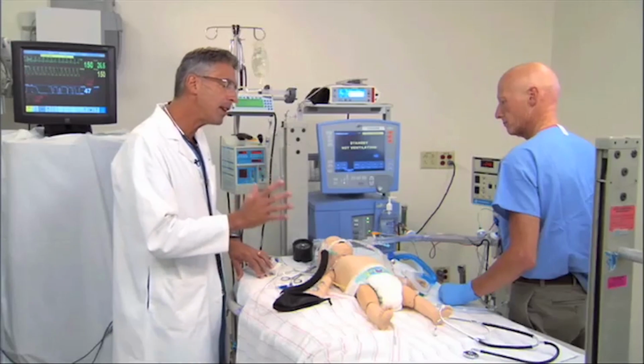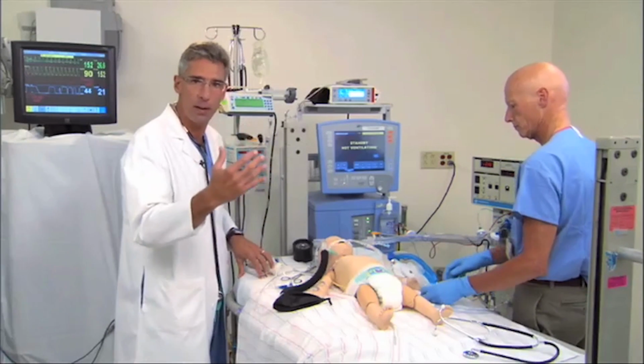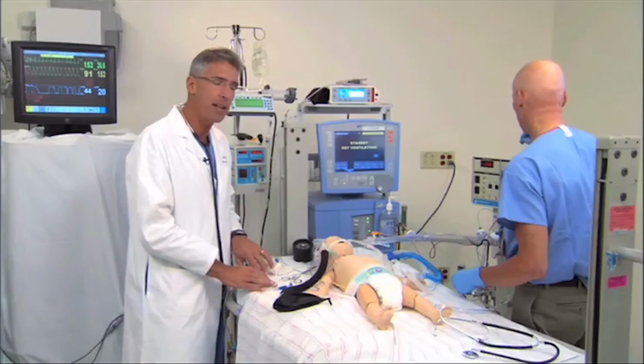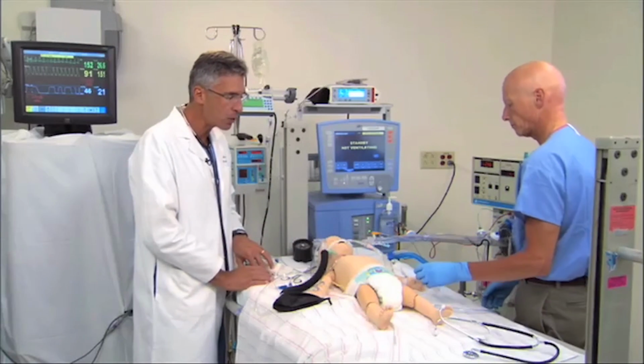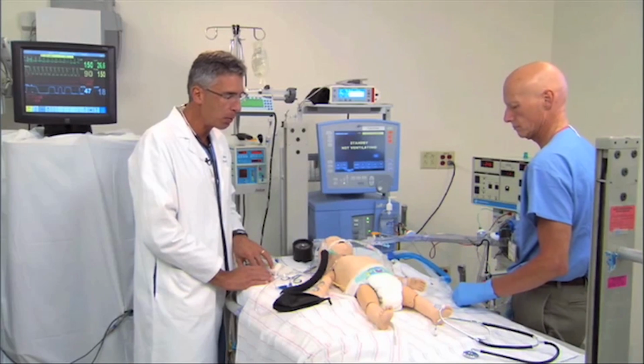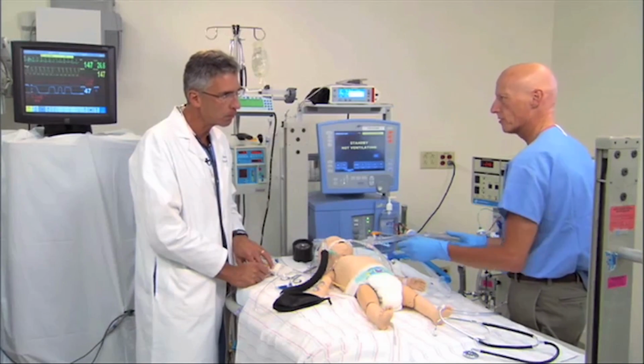Now, I think it's best to underdo it in terms of chest wall displacement rather than overdo it. Again, our goal is to prevent ventilator-induced lung injury. So I think now with this degree of chest wall displacement, it's an appropriate place to start. Barry, what do you think? What's your assessment? I think it's a good place to start, John. Okay.